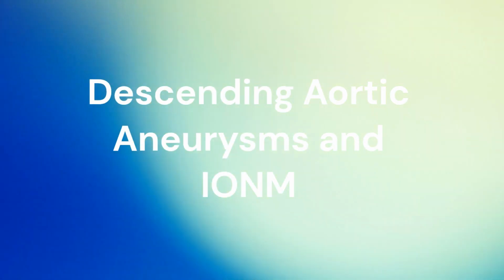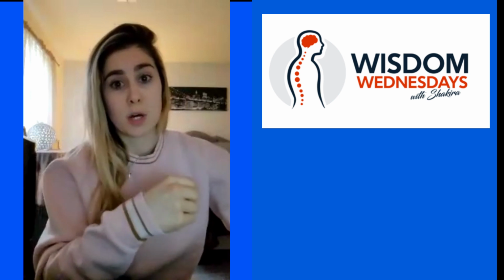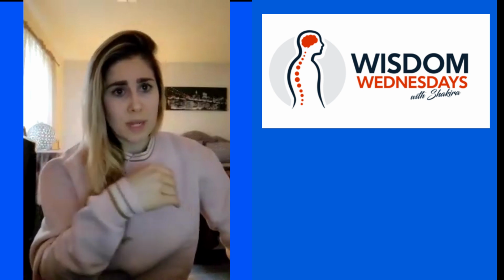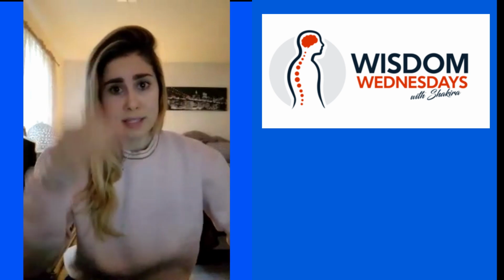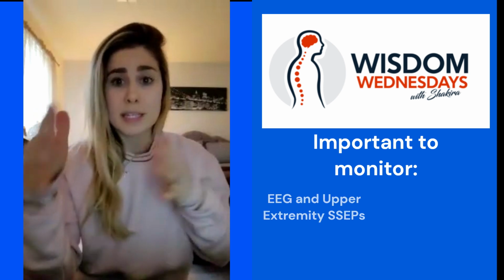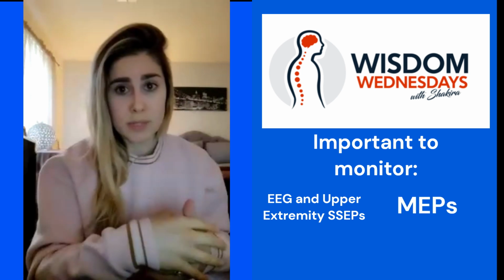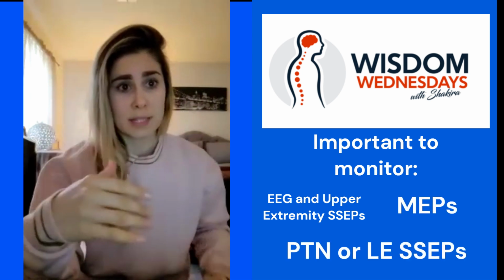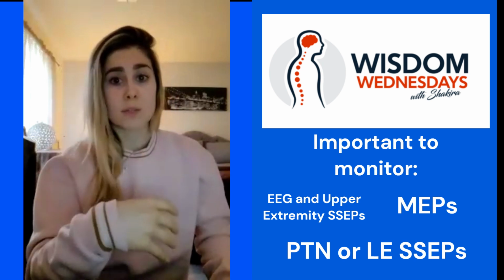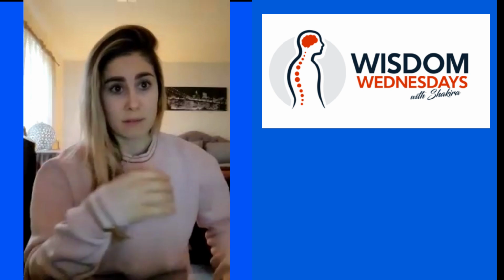So now let's think about the descending aortic aneurysm and how we would monitor that, since we just talked about monitoring an ascending aortic aneurysm with ulnar SSEPs and EEG. As we learned earlier, this descending thoracic aorta perfuses the spinal cord primarily. Therefore, in addition to monitoring the EEG and SSEPs of the ulnars, you want to also incorporate the motor evoked potentials and the posterior tibial somatosensory evoked potentials. This is because you want to make sure that the front of the spinal cord and the back of the spinal cord are adequately monitored for any possible ischemic events.